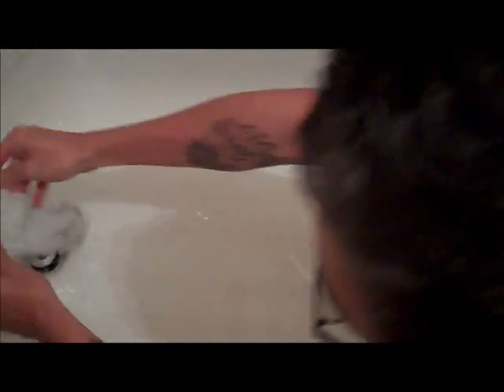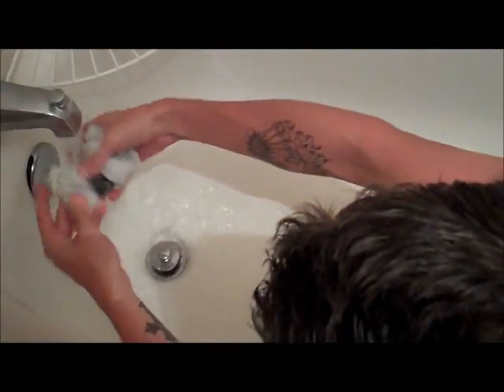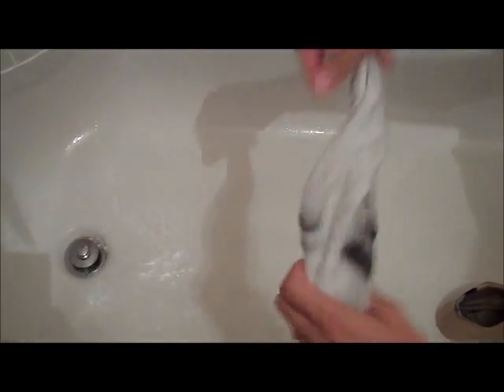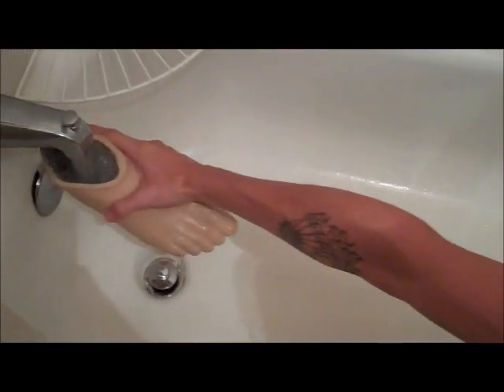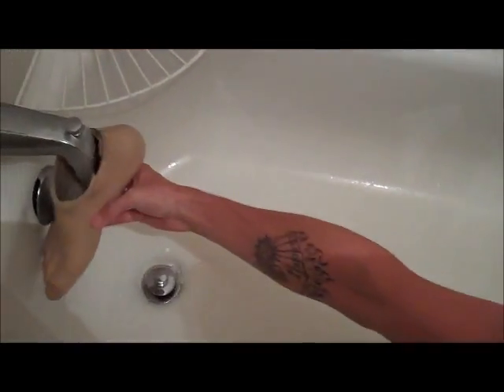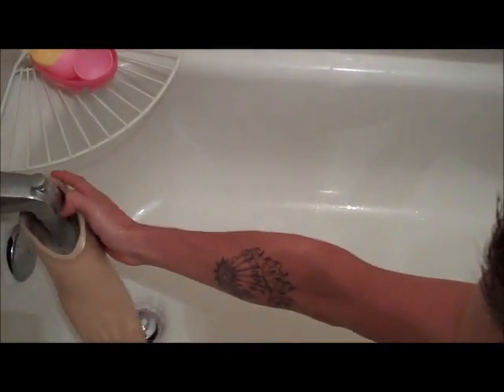Just rinse all this out. Fill it up. You can see all the dirt that was in there. Just getting all the salt water and crap out.